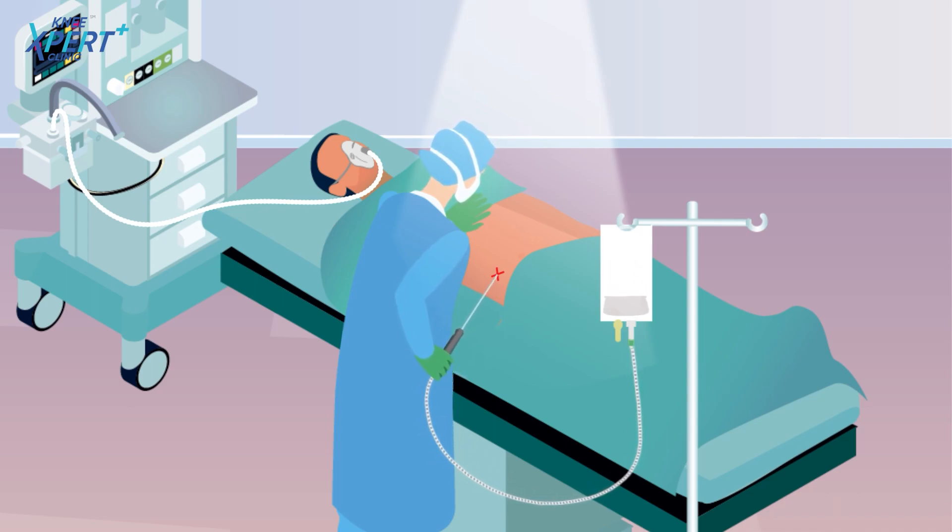In this procedure, the patient is given anesthesia and sedatives so that the patient does not feel any pain.